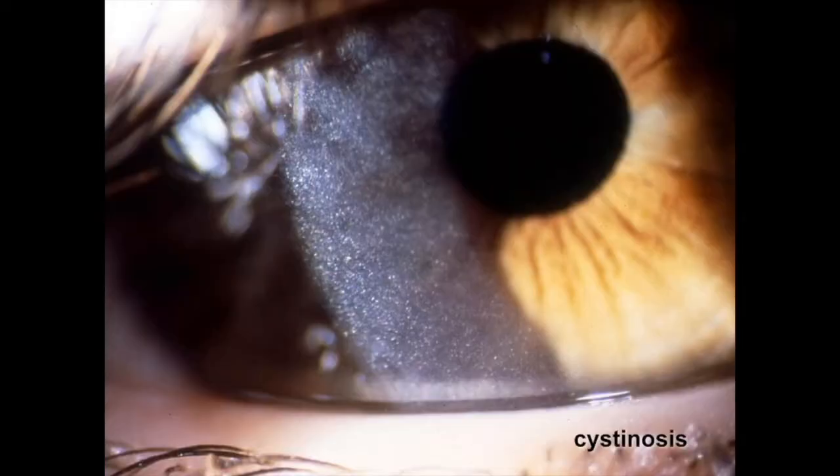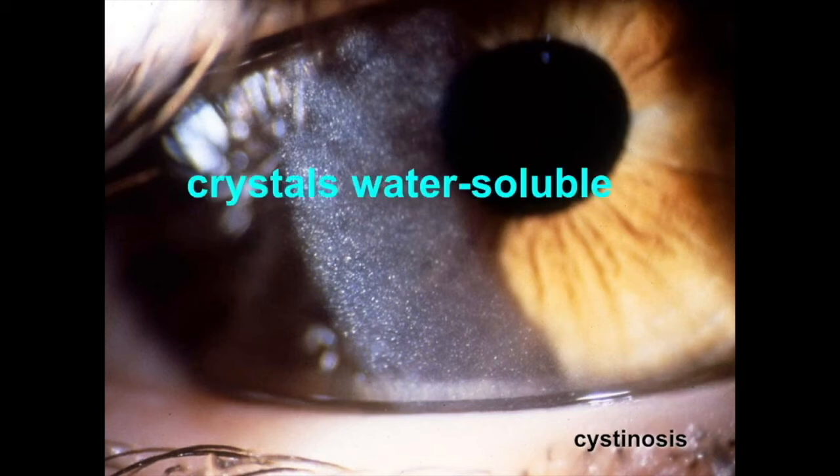Here's an example of cystinosis. The cystine crystals are soluble in water. If you want to preserve them, you have to fix in absolute alcohol. Here's an example of Dieffenbachia, phytocrystalline keratopathy.